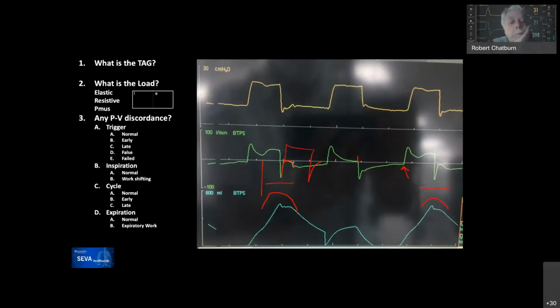For sure. And in this case, as Aman pointed out, sometimes paradoxically the answer is to decrease the sedation rather than to try to increase it, because there's a thought that maybe one potential etiology for this problem is that it's due to excess sedation causing the problem, causing the vent and the diaphragm to be out of sync.